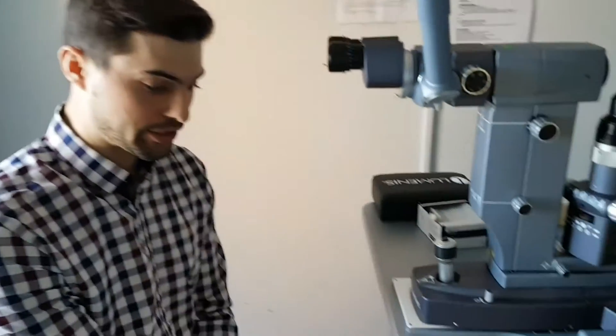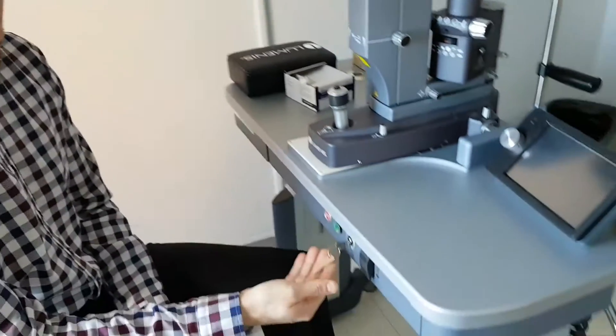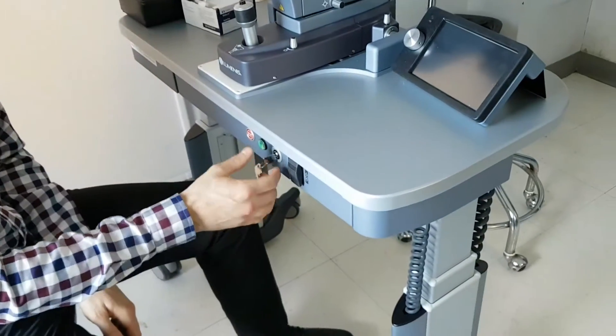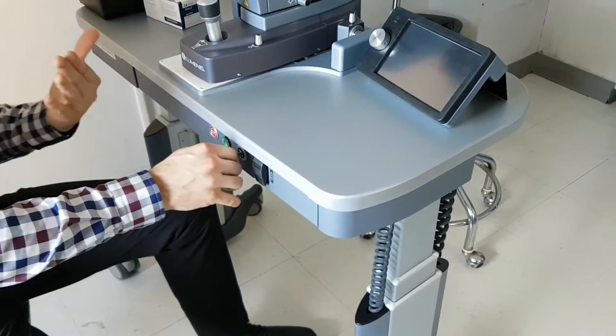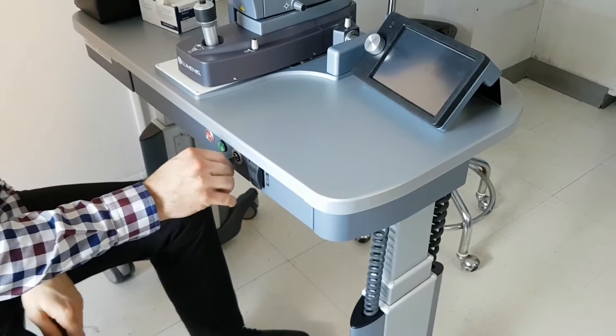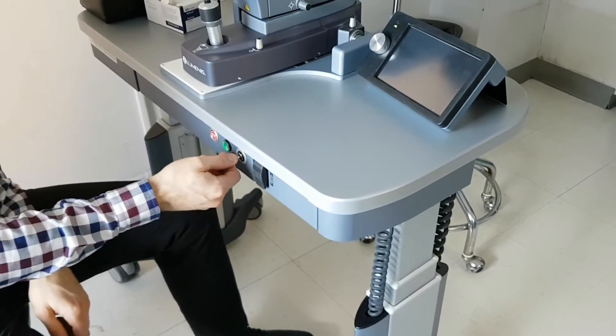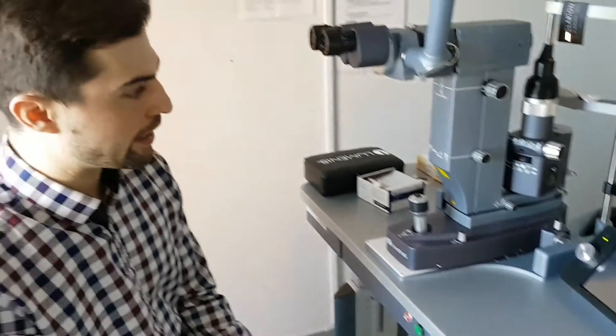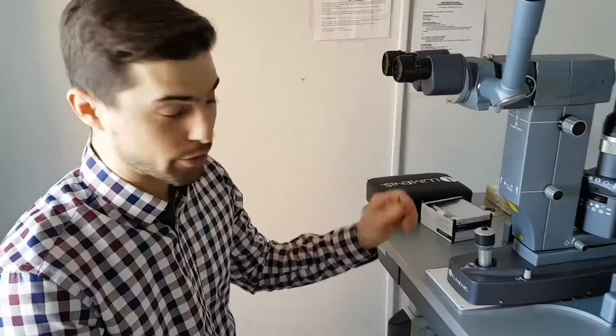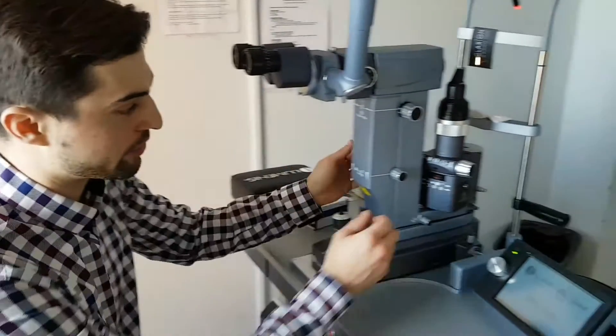To start off, what you need to do is turn the laser on. The laser is turned on with the key situated at the back or the front of the table. Once you've turned it on, everything powers up.